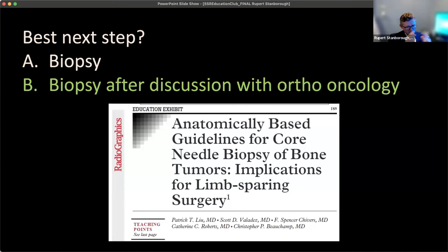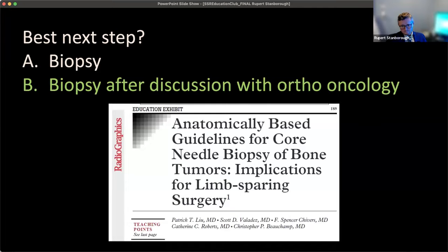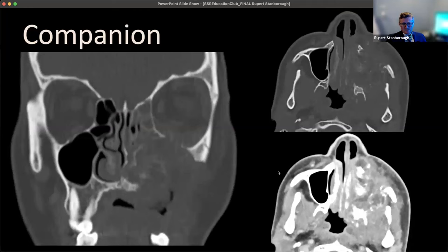In the ideal world, send these cases to a tertiary care center or speak to your ortho-oncologist about how they want you to biopsy these lesions. There are published guidelines giving good advice on the best ways to approach extremity tumors for upper and lower extremities. This was biopsied and was an osteosarcoma. The patient had a limb-sparing surgery — partial resection of the tibia, bone graft, and metal hardware to keep everything stable. Key features of osteosarcomas: cortex destruction, a soft tissue mass component, and osteoid matrix — all three present in this case.